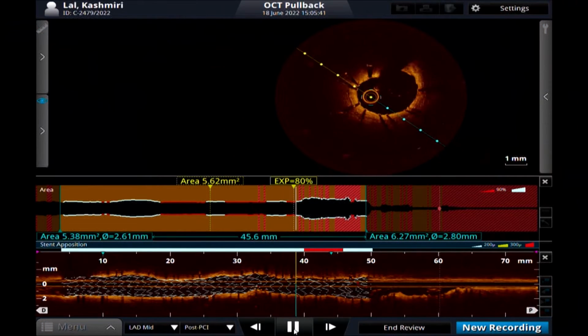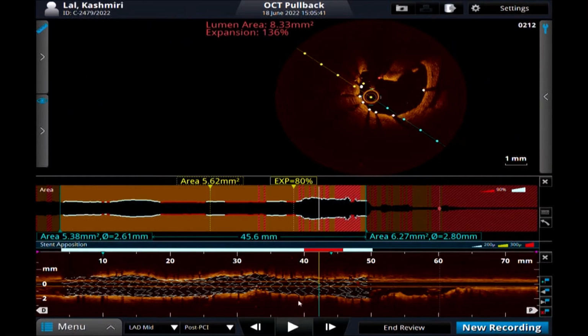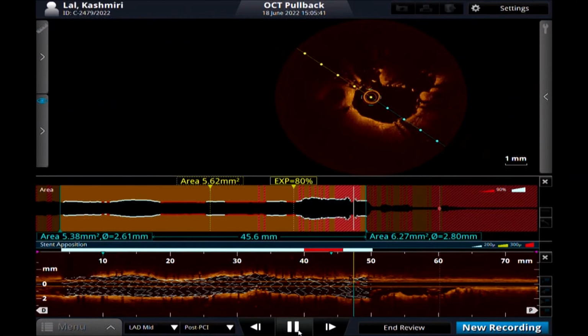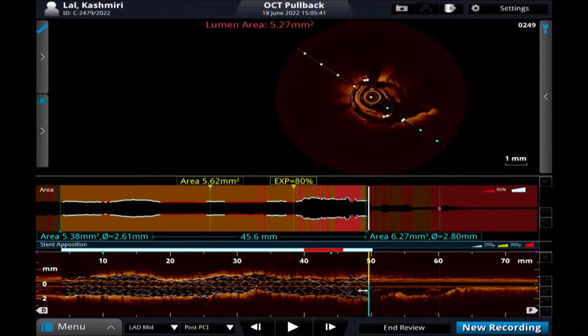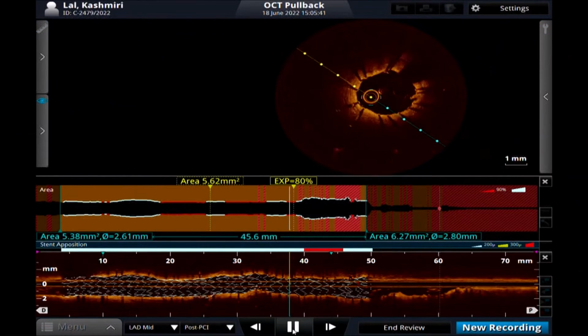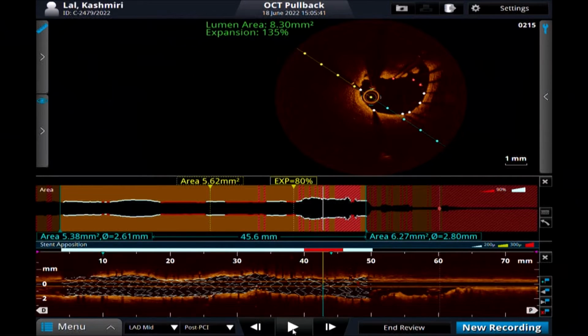Can you go back to 35 something? 35, Puneet. Just complete the run and then we can come back. Yes, please, at the level of 35. No, show us 40. Here we are. 40, 50. Just run it. So let me give a 3 millimeter NC balloon.